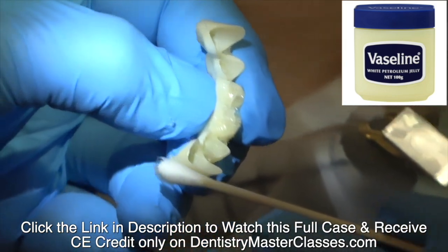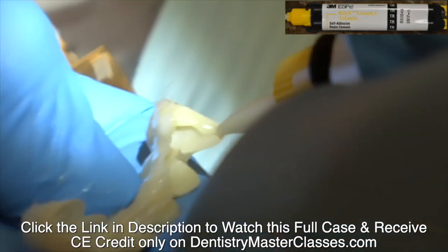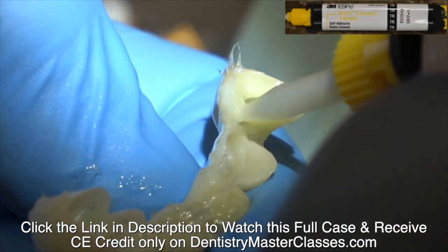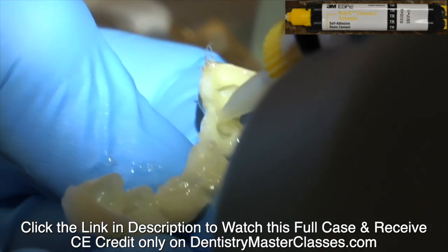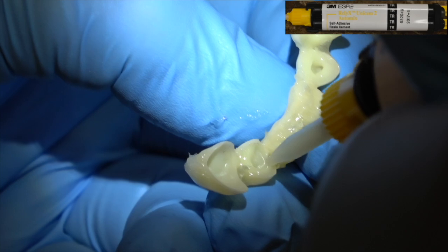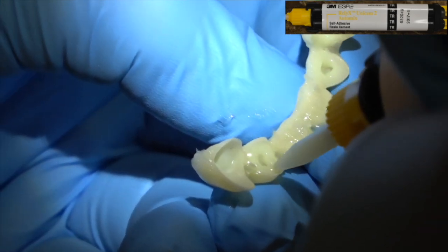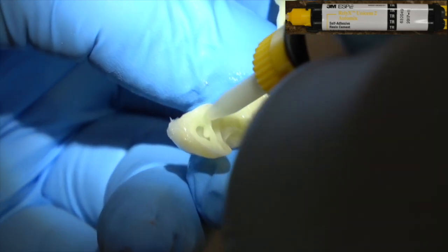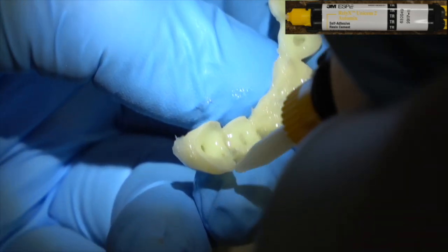You're just placing the cement around the rim on the inside of each retainer. To be sure the cement gets into the divots in the teeth, I'm squirting it into those little divots. If you just place the bridge on there, there's going to be a void in the divot — it's not going to go down into those little retention divots. So squirt some in there.